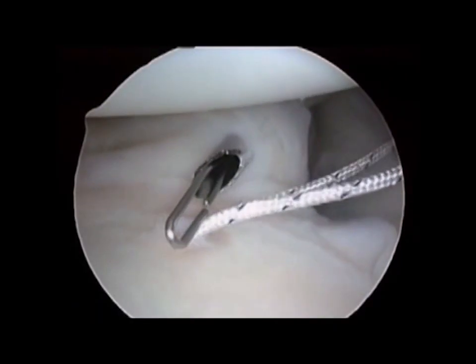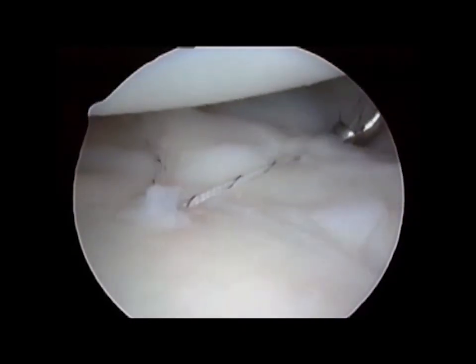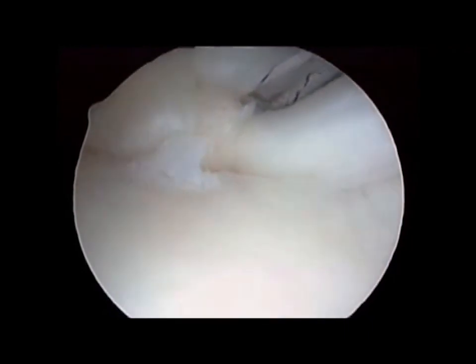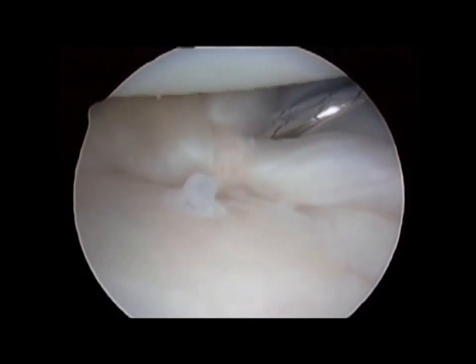A 6 o'clock anchor is placed in this same patient, and after suture passage, we can again see significant volume reduction inferiorly and an inferior bumper effect that's achieved as well.